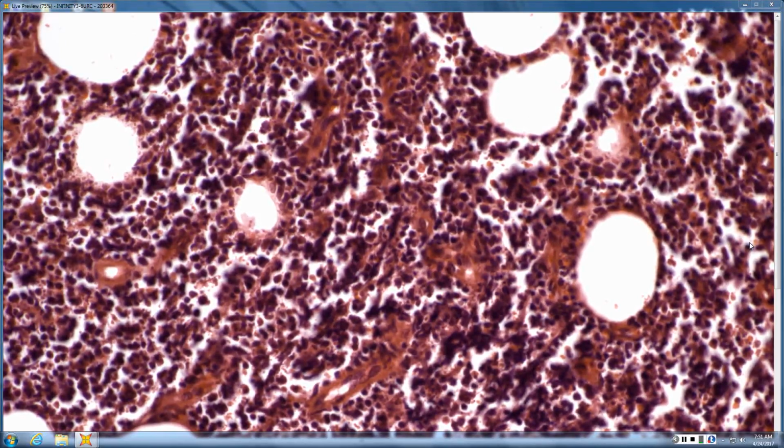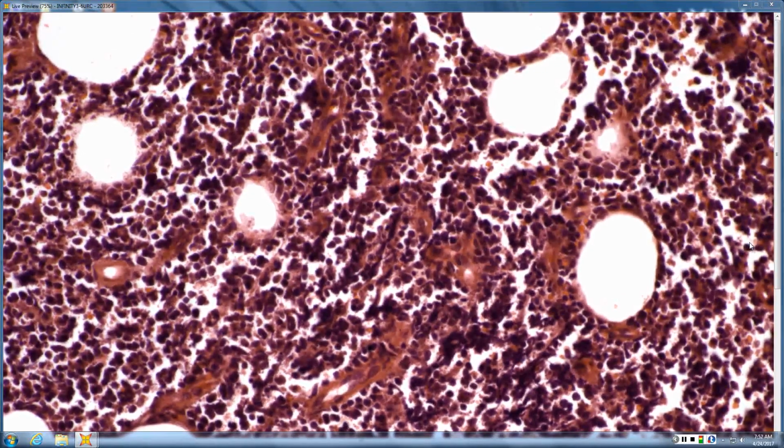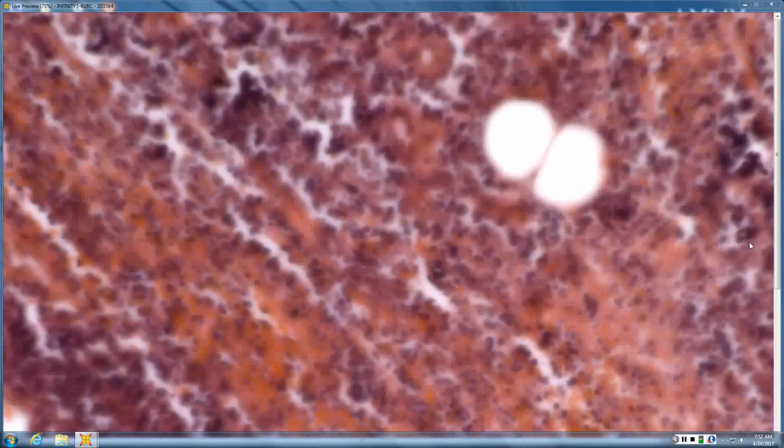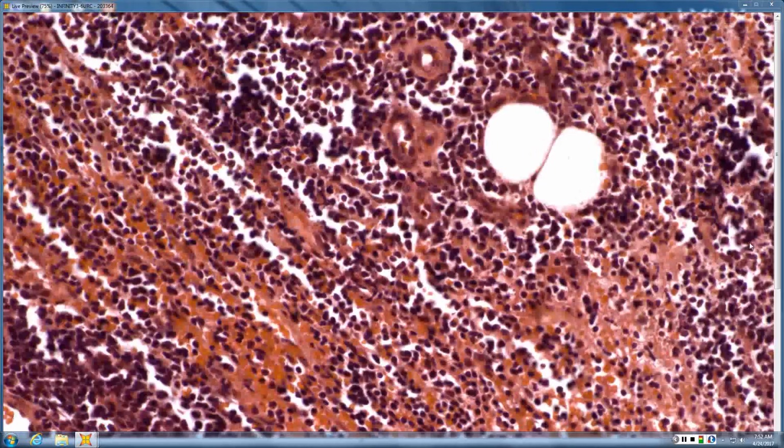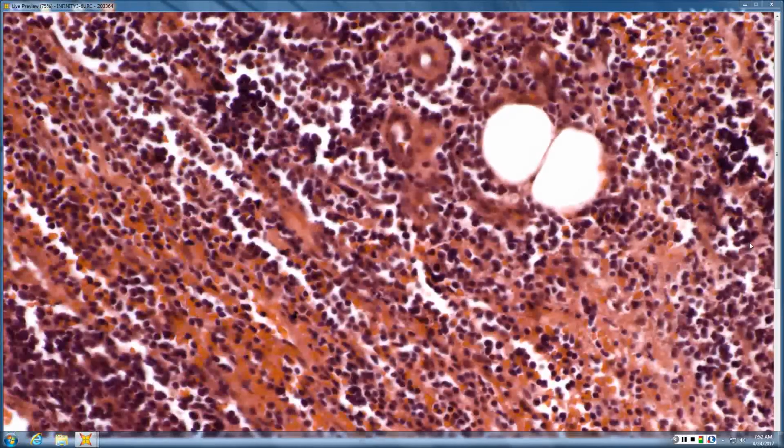When you say cleaved, what's that look like histologically? Is it just like a notch out of the... Yeah. So instead of being a round nucleus, it's got a notch cut out of it. So if anything, these are blasts and sheets of blasts. So lymphomas with centrocytes are better differentiated. Blastic lymphomas are more primitive. They're more poorly differentiated.